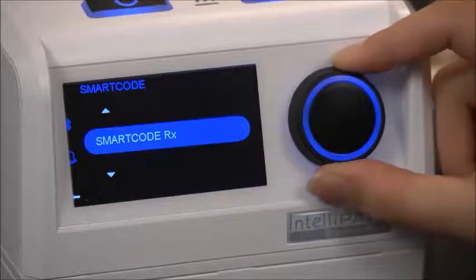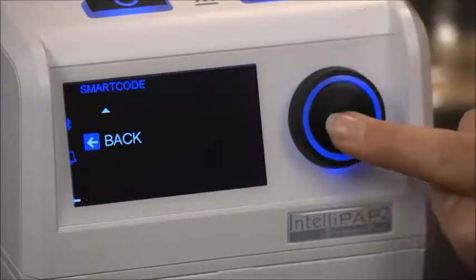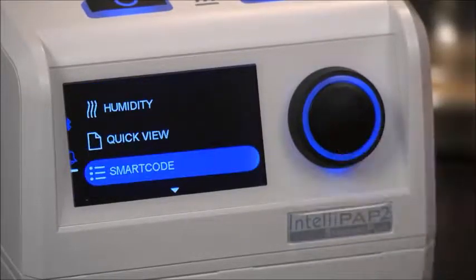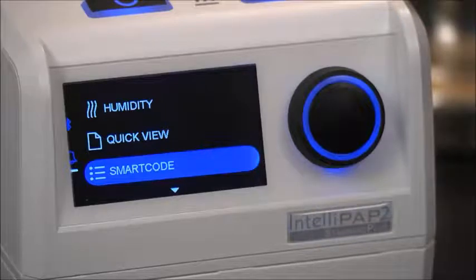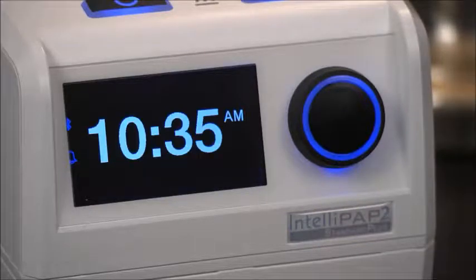The back button will take you back to the main menu, or the screen will automatically return to the main menu after 2 minutes without user action. You will now be able to retrieve your SmartCode data if contacted by your provider.